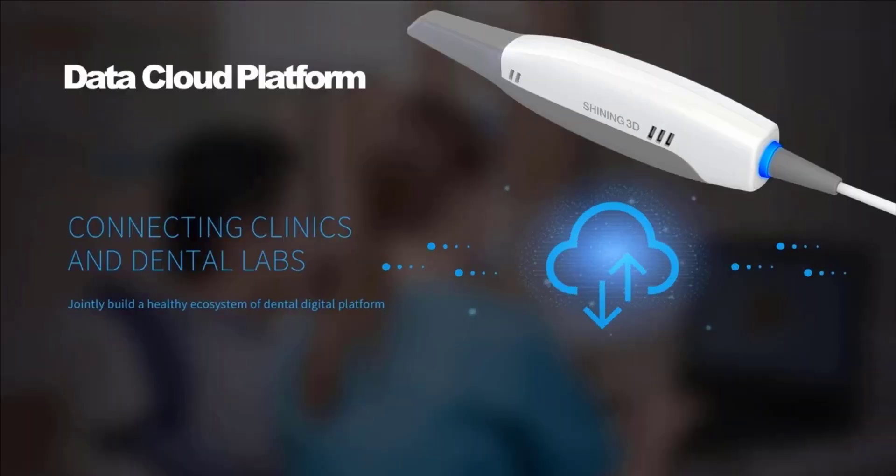Hello, let's see how to manage the data cloud provided with the Shining3D intraoral scanner.